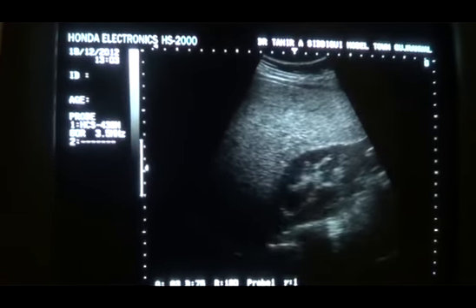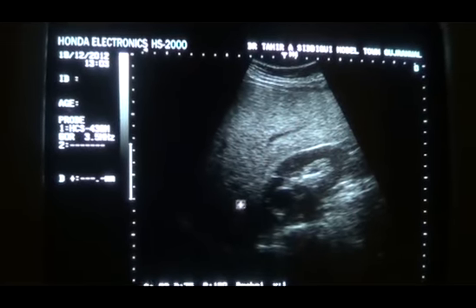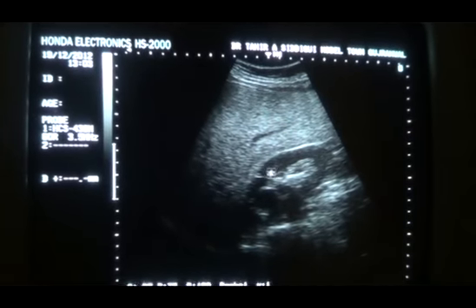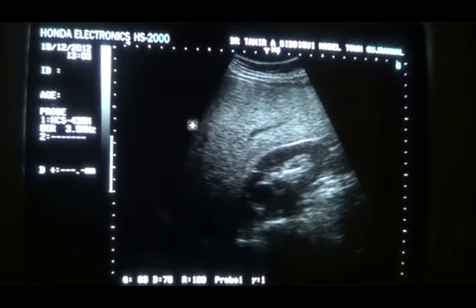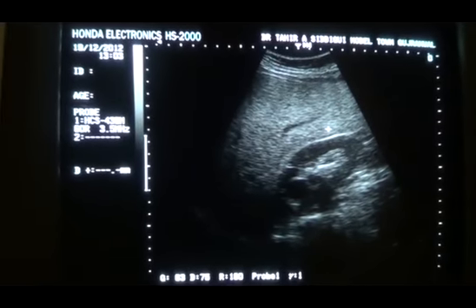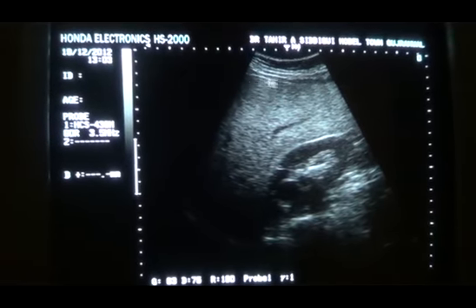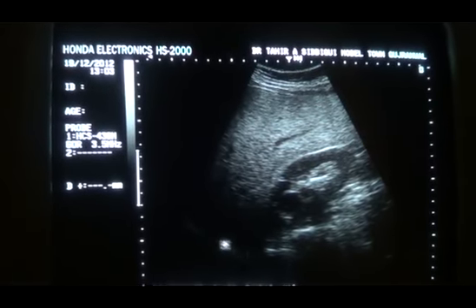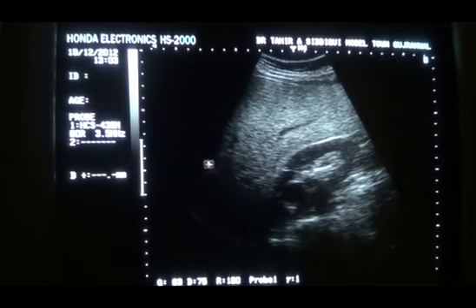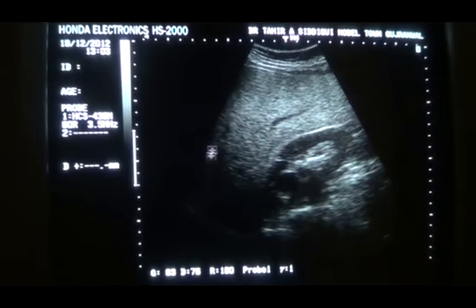Number 2, let's compare it with the kidney, and you can see that the parenchyma of the kidney is appearing black, not because of a disease process, rather because of the sound waves being absorbed by the fat in the liver. Now this is the fatty liver anteriorly, the outer surface is smooth. This is the thin diaphragm. See the attenuation of sound waves has reached this area because of the fatty liver anterior to this part.